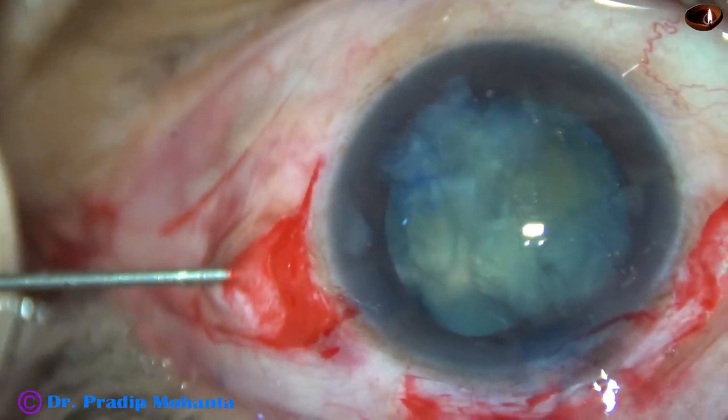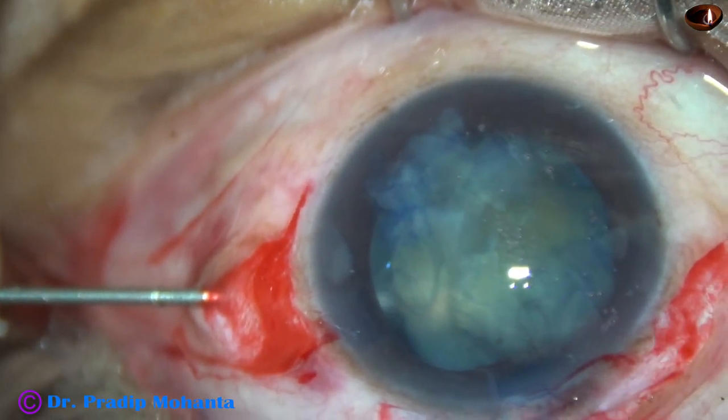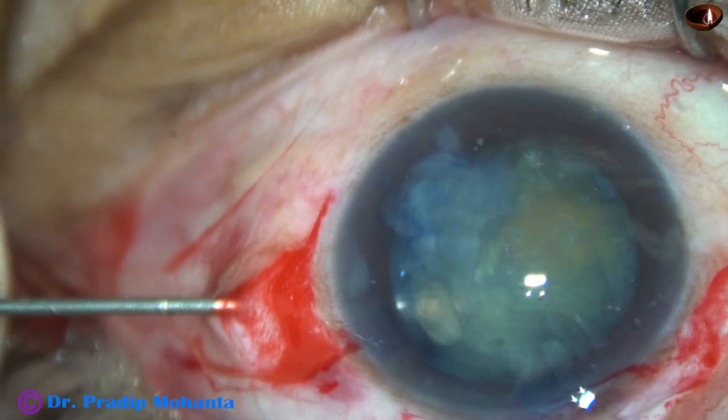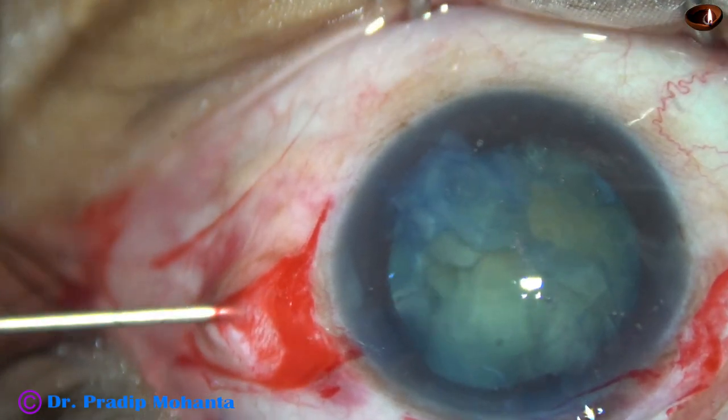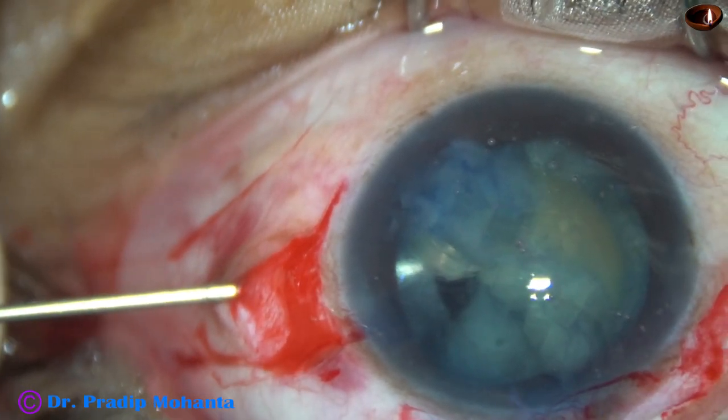And with the hook, I placed it over the needle. This technique is also known as PAL — posterior assisted levitation.